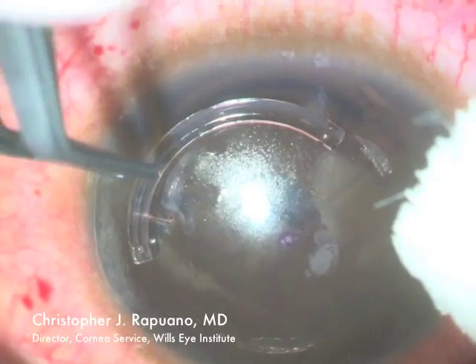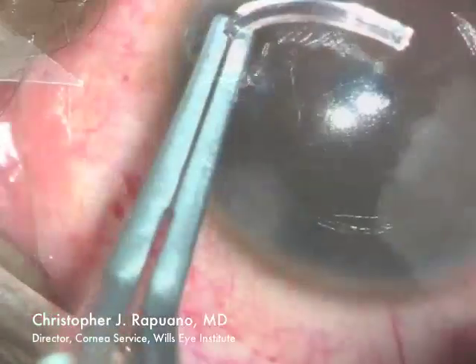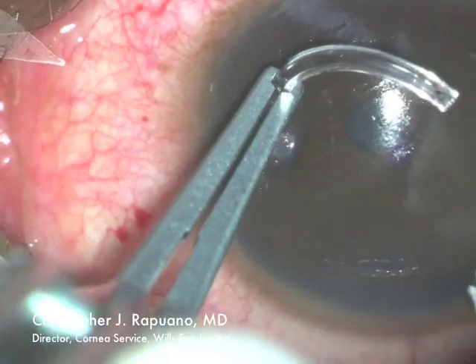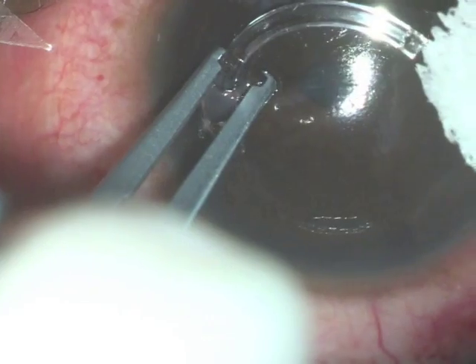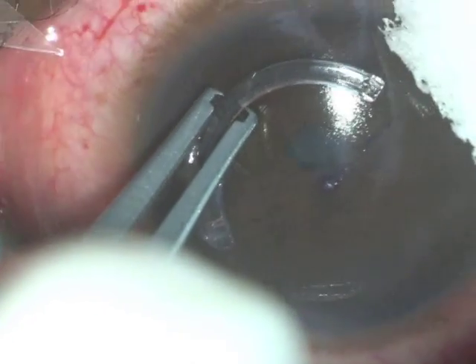A deep corneal incision was also made by the femtosecond laser at 9 o'clock in this view. Here, a 450 micron intacs segment is being placed in the inferior aspect of the cornea.